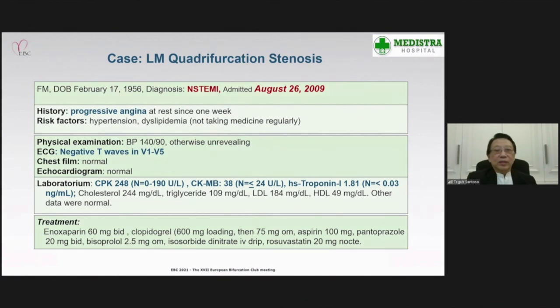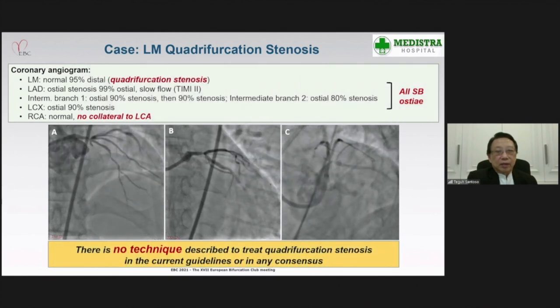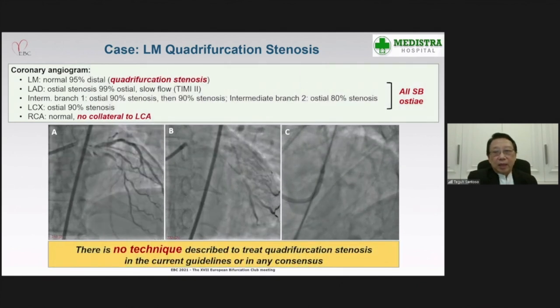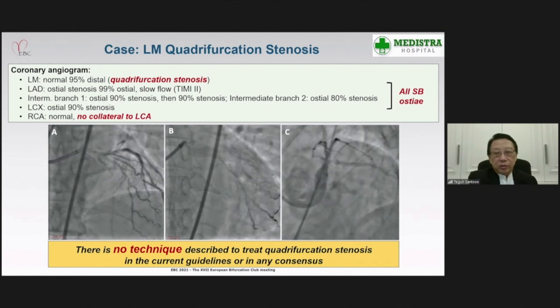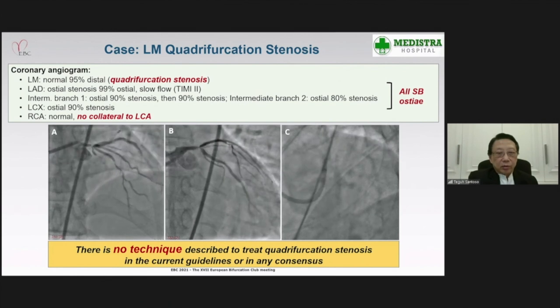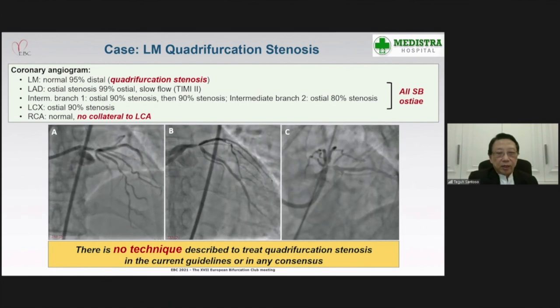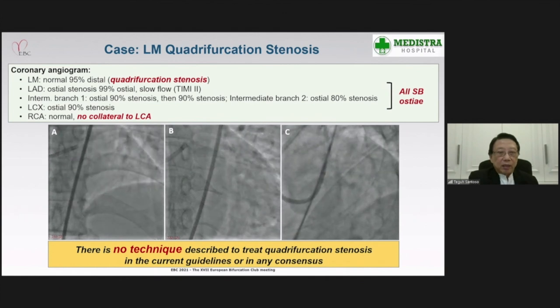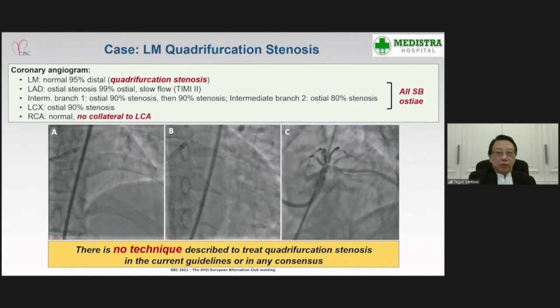The coronary angiogram revealed left main quadrifurcation stenosis with critical stenosis in the distal left main and also critical stenosis in all side branches, as shown here. And there is also stenosis in the first intermediate branch, and flow in the LAD was sluggish, and there was no collateral from the right coronary artery, which was normal.